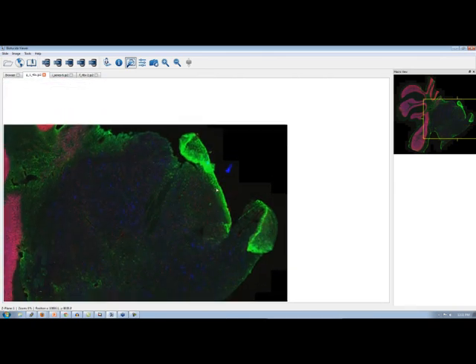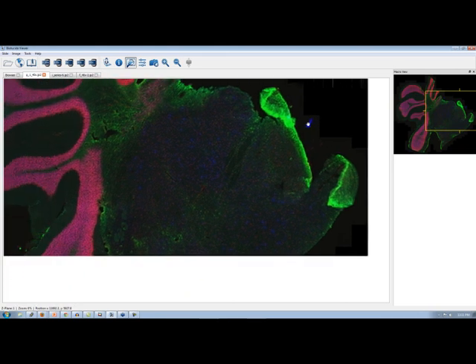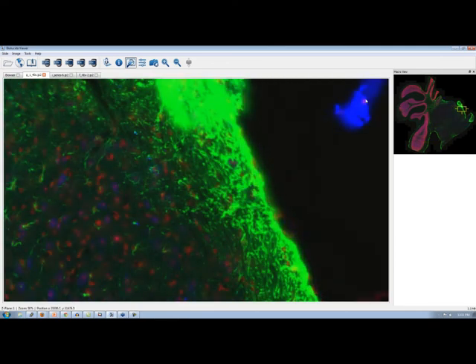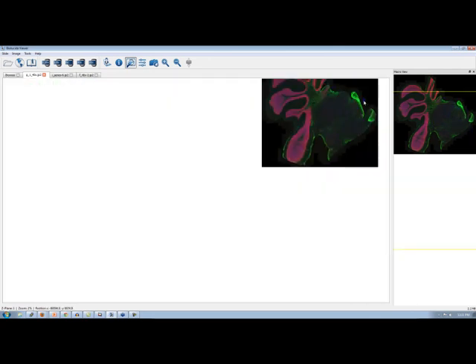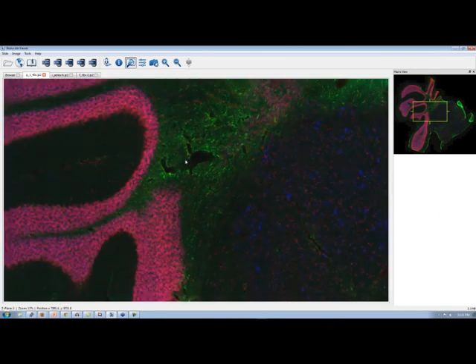So to better show this, in the upper right hand side you can see this little blue region. What I'm going to do is I'm going to move the blue region basically up into the upper right hand corner. And now as we zoom in here, your view is going to change, but that region will stay in the exact same place. Right. So as you can see on your screen now, we're zooming in, that's never changing. If I zoom out with that there, it will stay in the exact same place, and that works no matter where you are on the image.